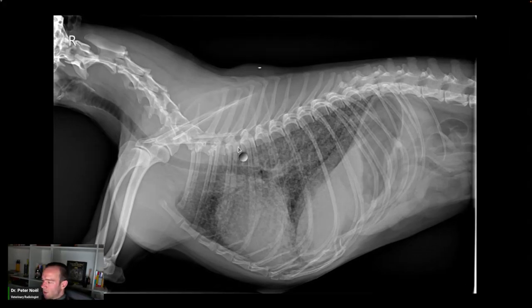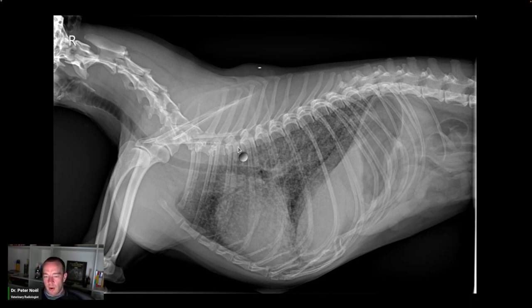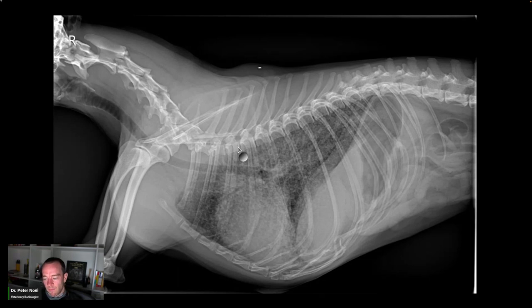The diagnosis for the last case was just pneumonia — straight up pneumonia. Don't make it more complicated; just treat them for pneumonia. I was trained that you're better off missing a pulmonary nodule than missing pneumonia. A dog with cancer will come back; a dog with pneumonia could come back dead. So you err on the side of pneumonia. The last case did not have pleural fluid — there was no pleural fluid in that dog. It was a fake-out pleural fluid.